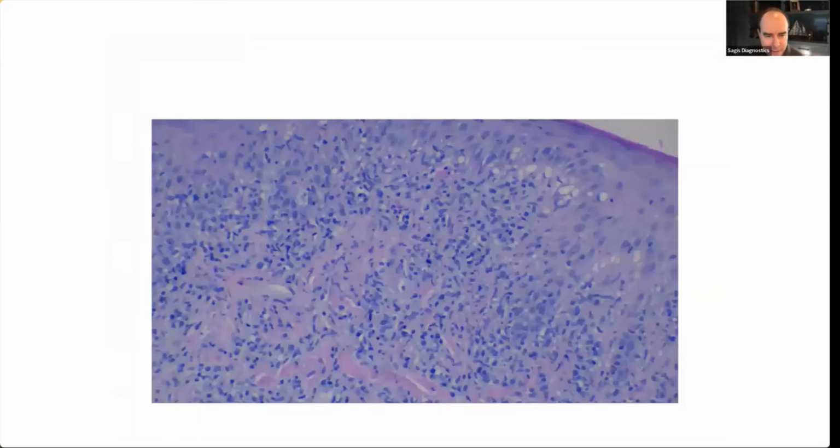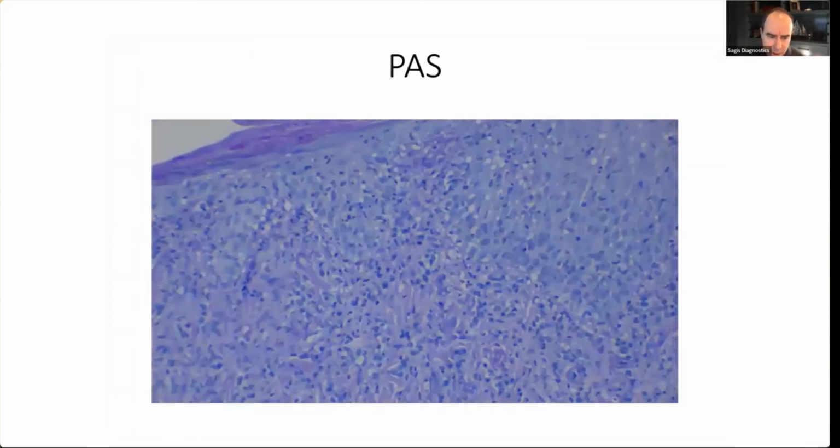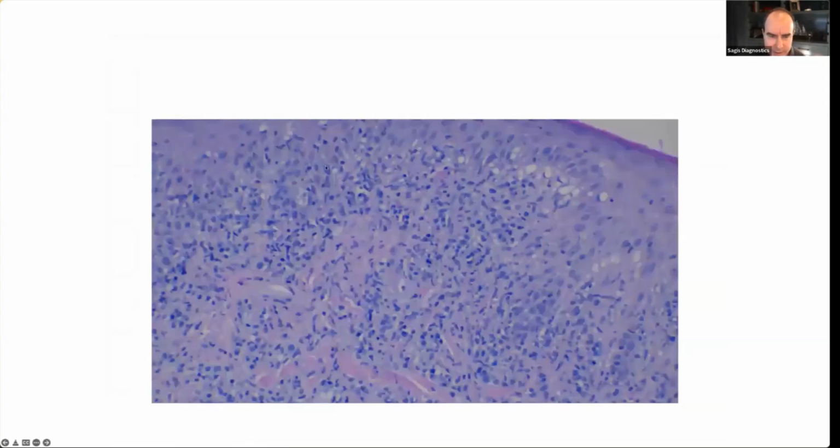Finally, we have another case here. We have these nondescript cells right in here, but they seem to be mixed. We have some enlarged activated cells. We have some neutrophils and whatnot. And this doesn't really look neoplastic. It looks more reactive, but we have epidermotropic lymphocytes and macrophages here. So the question is, could this be infectious? And could these macrophages be harboring organisms?